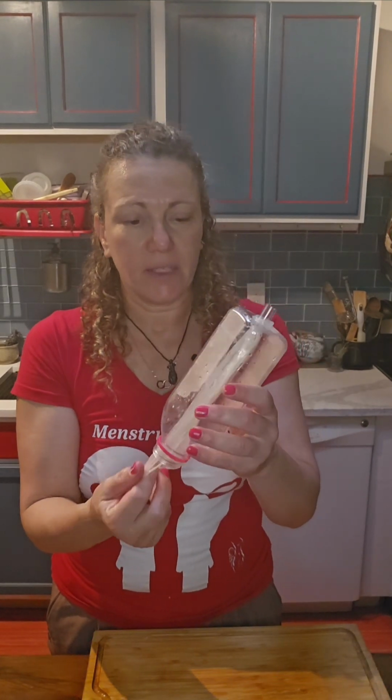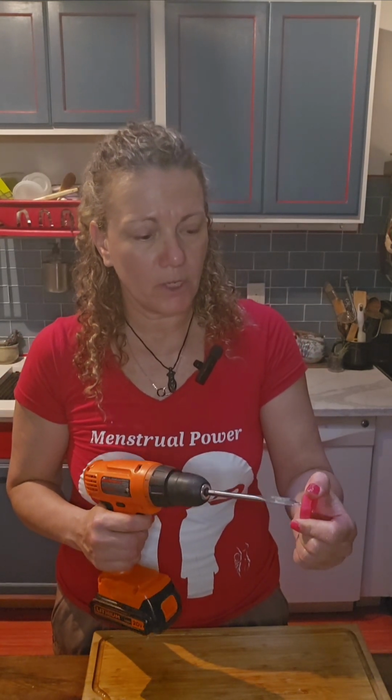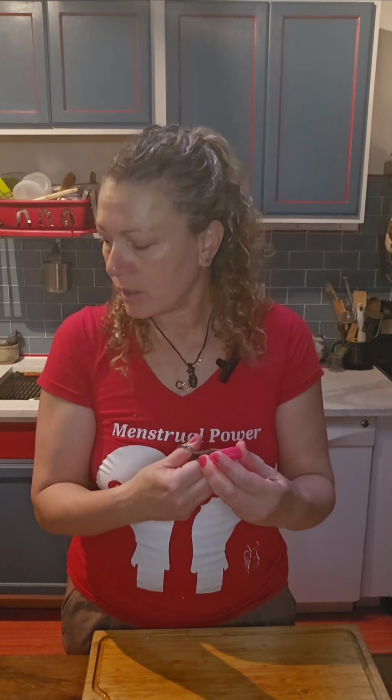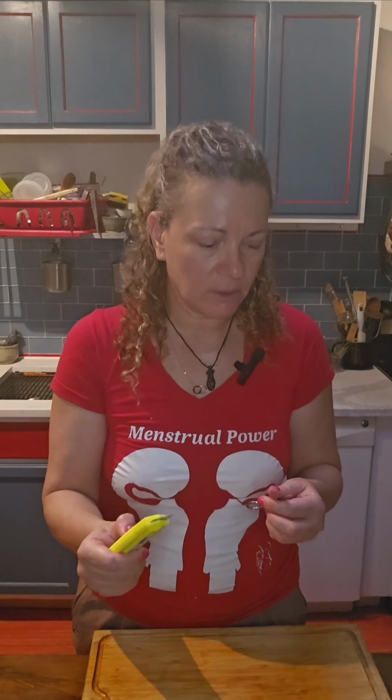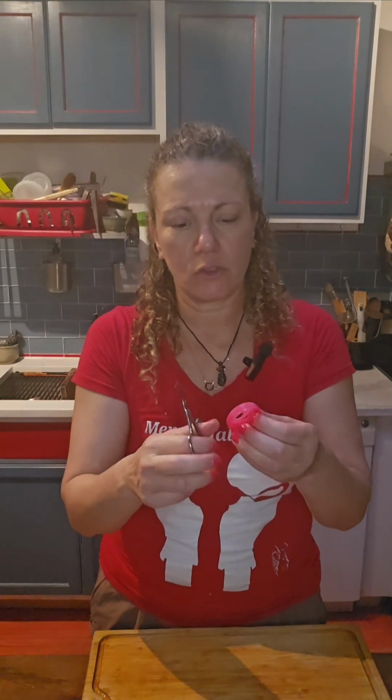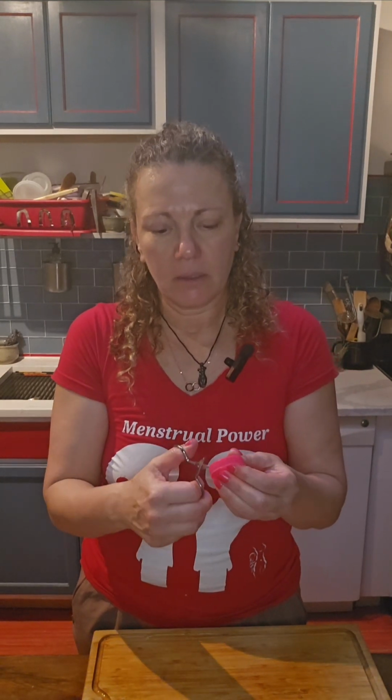The next phase in building the Singina model is making a hole in this part, in the cup. So I'll start the hole the same way as before. And here you can take scissors or this kind of thing, whatever you feel more comfortable with. And we want to make the hole as big as possible, while remaining the screw part, the part that can screw on the bottle.